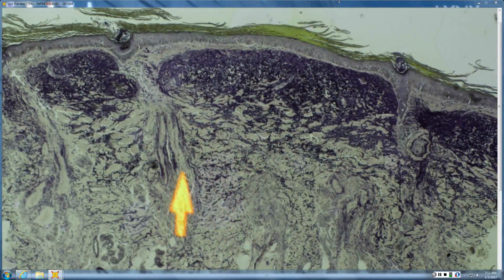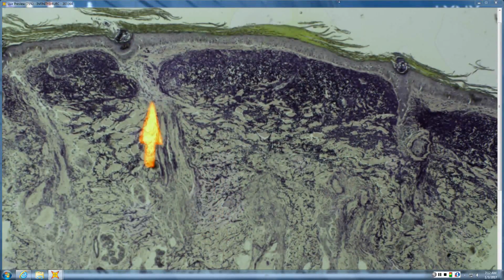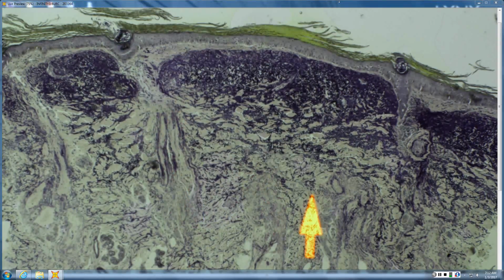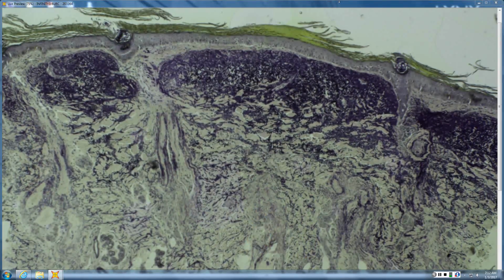So, if maybe clinically there's some concern, is this scarring, or is it pattern? If it was scarring, you would see obliteration of the elastin within these fiber sheaths or elsewhere, because in scars you don't really get that preserved elastin. And so this is pretty normal, and it can be helpful to say that there's no evidence of a scarring alopecia.